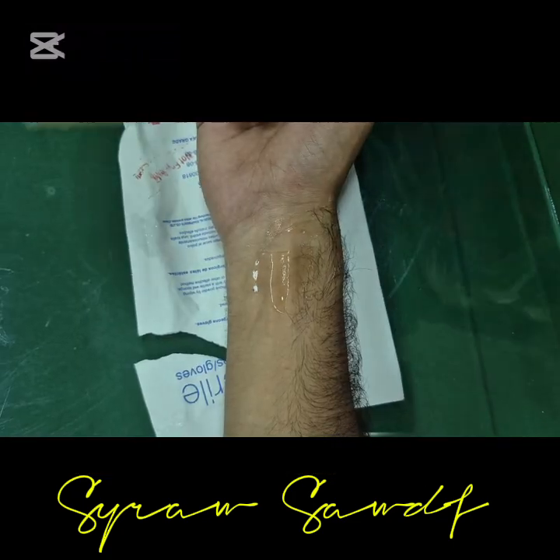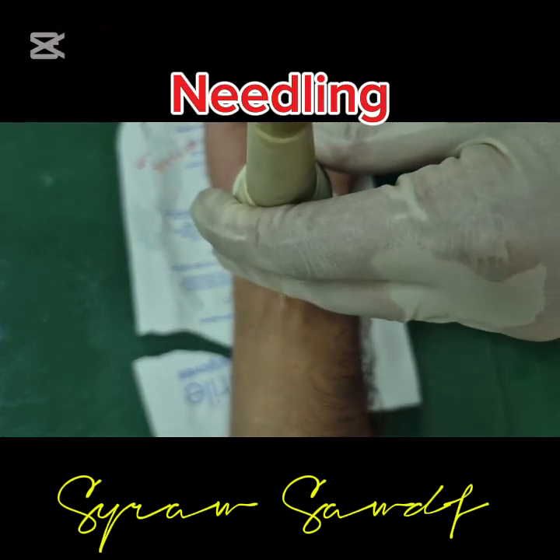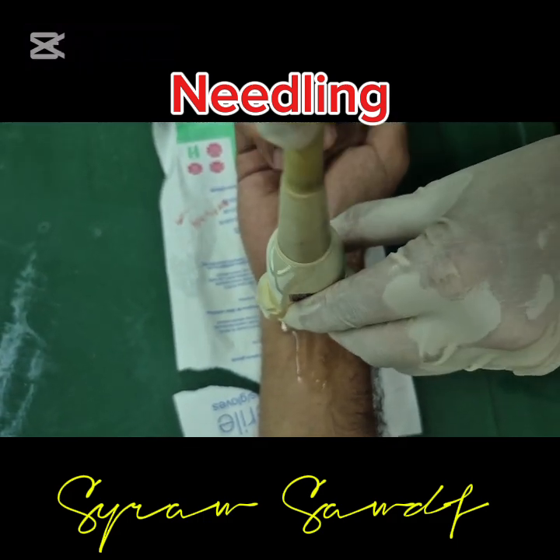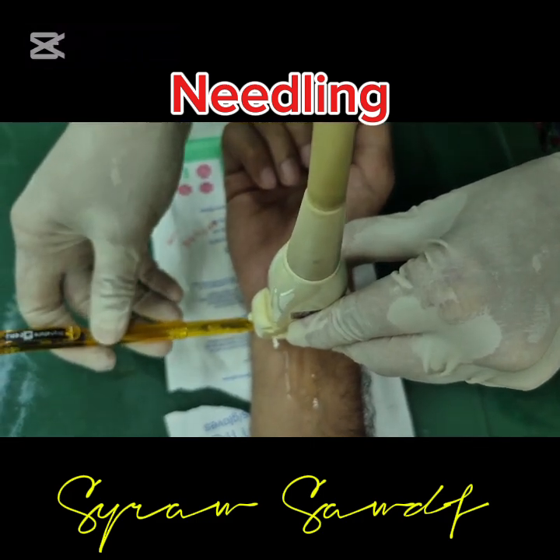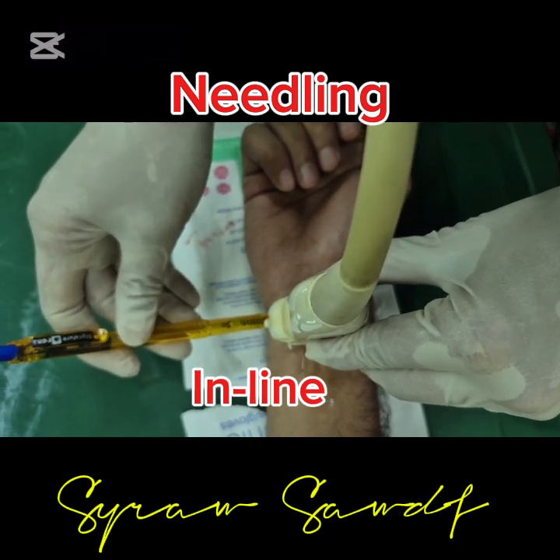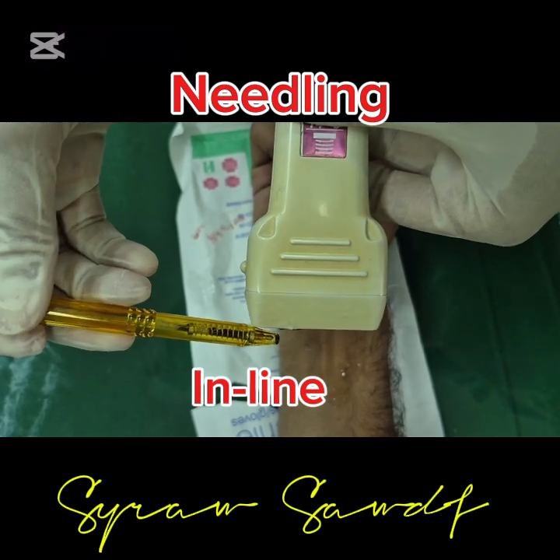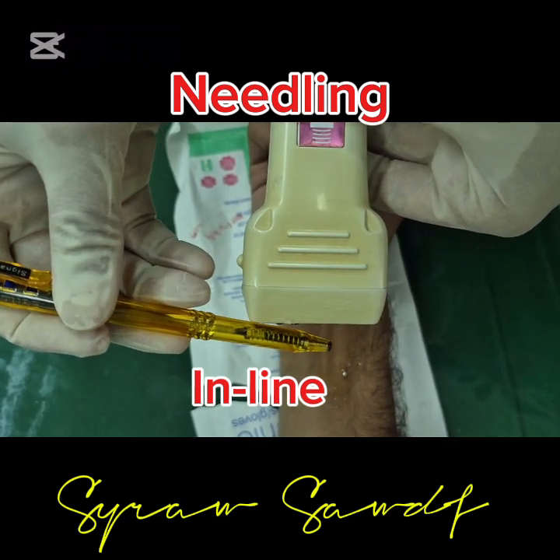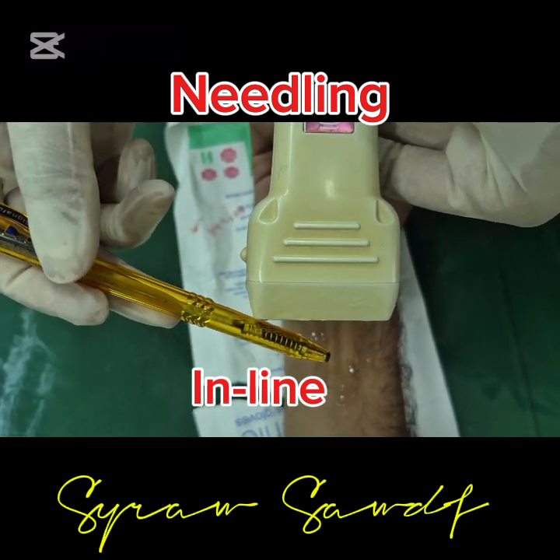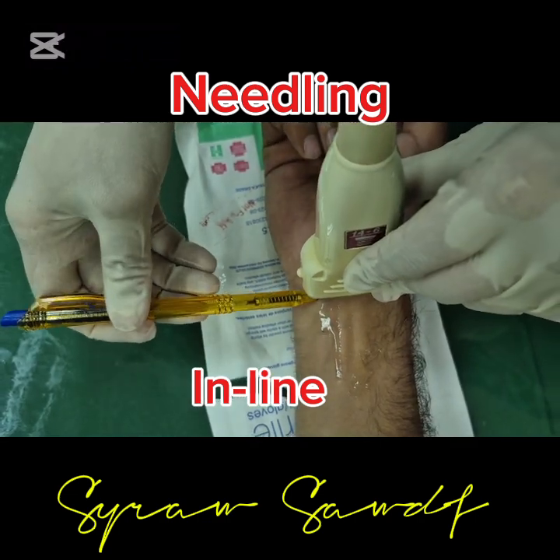Okay, now let me show you what is the inline approach of needling and what is the out of plane needling technique. So while keeping my probe in the transverse axis, when I'm coming from one side like this, from this side, it means this is in plane. Why is it in plane? Let me show you. What I'm doing here is advancing my needle in the plane of the beam, so you will be able to see the whole length of the needle, right? So this is the in plane technique.